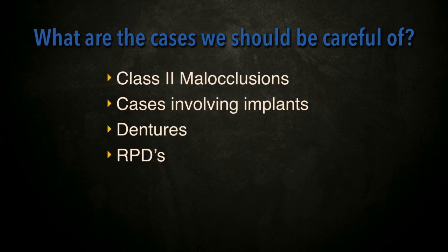If we miss vertical on dentures and RPDs, the base will literally get pushed into the tissue.